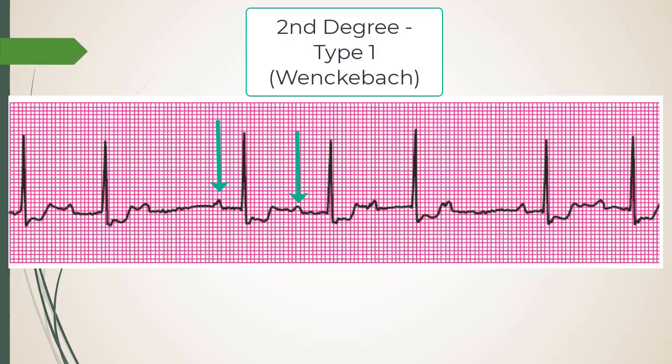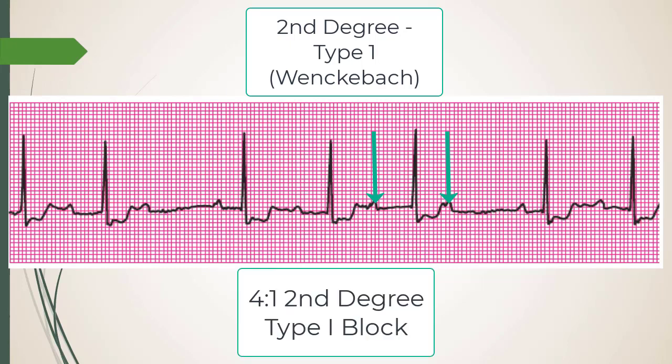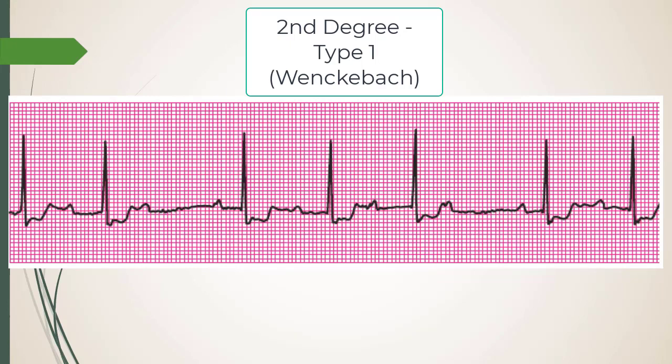Looking at this strip: after the drop, the next PR interval is long — greater than 0.2 seconds — and then it gets longer. So I count one, two, three, four — it's a 4:1 type one AV block, Wenckebach. I also see ST segment depressions and possibly inverted T waves, so I'd get a full 12-lead EKG.